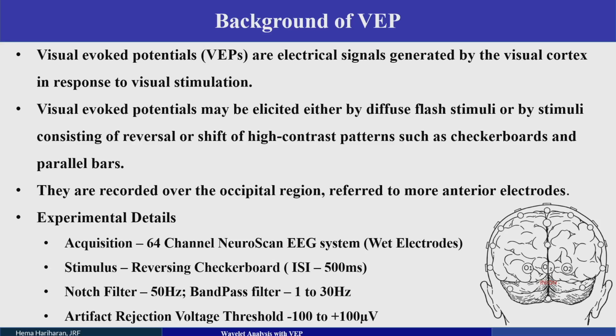How the brain perceives this visual stimulus happens in the visual cortex, which is mainly present in the occipital region of the brain, that is, at O1, OZ, O2. Here the visual potentials are the same as the auditory evoked potential, having the N1, P1, P2 complex.